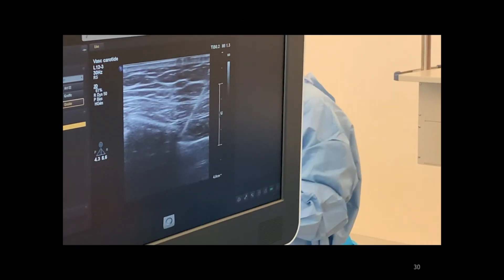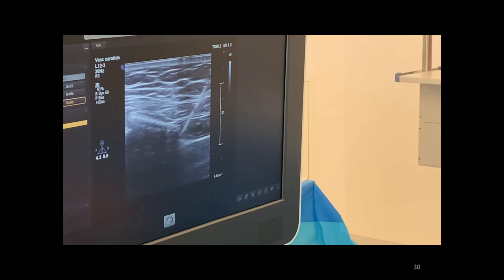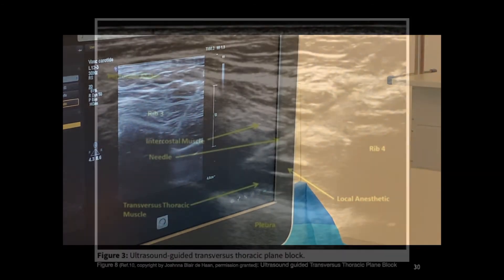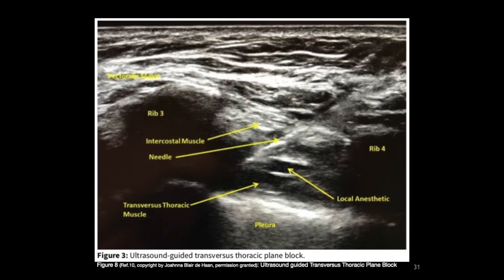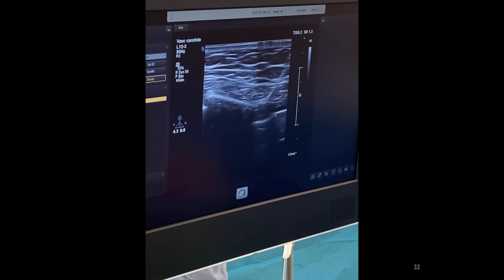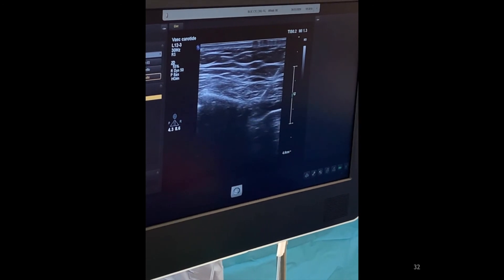In summary, here is the right shot at the right place leading to the right block, with its end result shown on this sagittal parasternal ultrasound image. After block completion, the patient is closely monitored for 20 minutes.